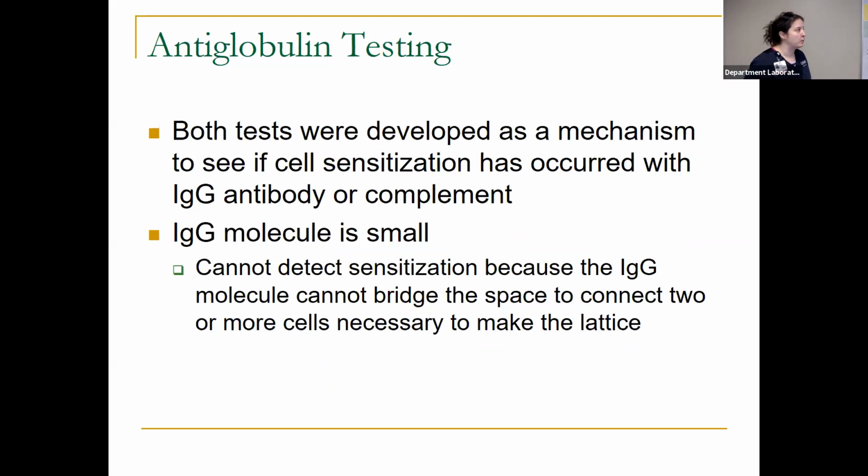And again, the purpose of your antiglobulin test is that we want to identify any unexpected antibodies. Now, when I say unexpected antibodies, think about our ABO antibodies that we have talked about. And remember Landsteiner's rule, if you lack the antigen, you can build the antibody. ABO antibodies, such as our anti-A, our anti-B, those are expected. Those are naturally occurring. So if you're type A, you have the A antigen on your red cells, you have anti-B in your plasma. That's expected. We expect to have that.